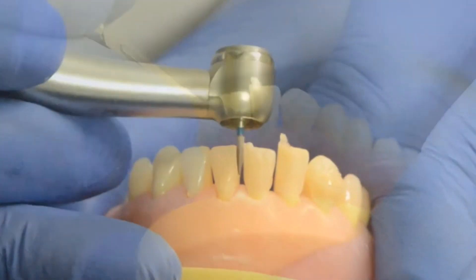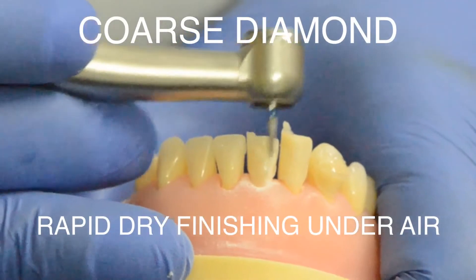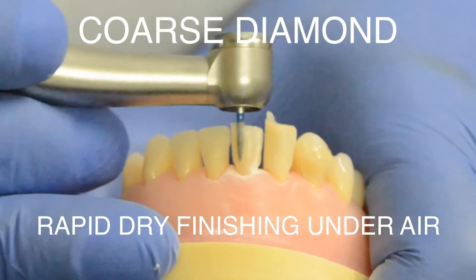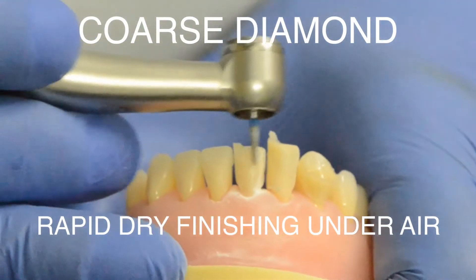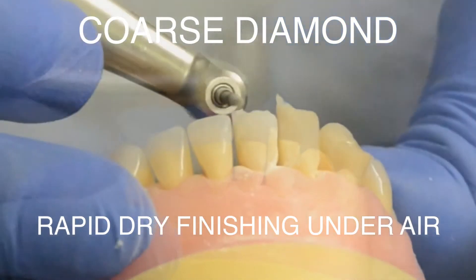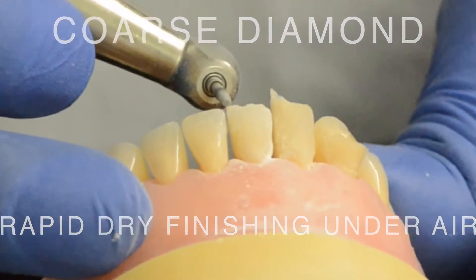The next step is to use an air rotor burr — a coarse diamond — without water coolant in an air rotor. Some of you may be wondering: what about the tooth, is it going to get fried? Well, not if your assistant is directing a blast of air using a three-way syringe on the head of the burr as you use it to cut down the composite.